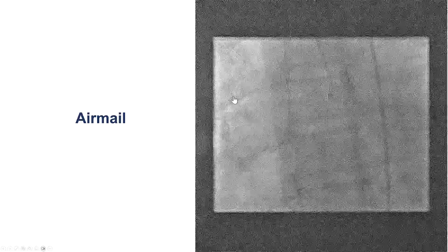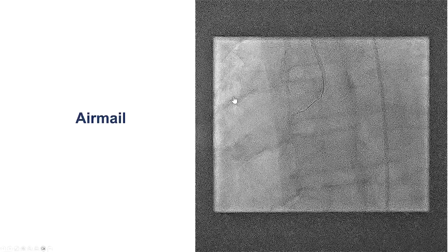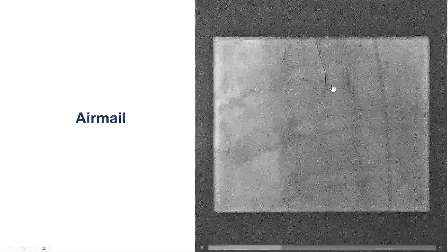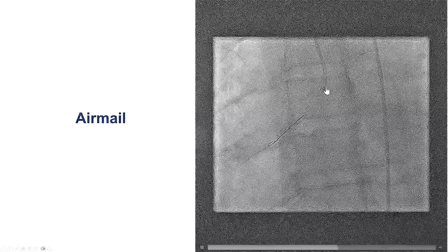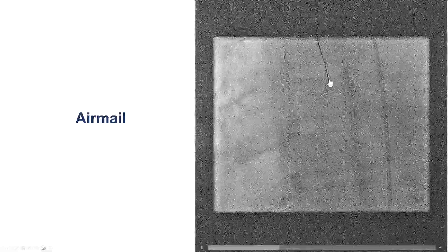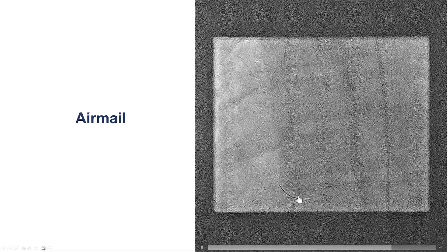We started with the right coronary artery, but once again we had a lot of difficulty engaging the vessel, because every time we would go close, the pressure would dampen and the catheter would come out. Instead, we used a technique called Airmail, which means we have the catheter sitting outside the ostium of the coronary artery but facing towards it. We then advanced a guide wire — a workhorse wire in this particular case — and that wire advances and goes into the right coronary.